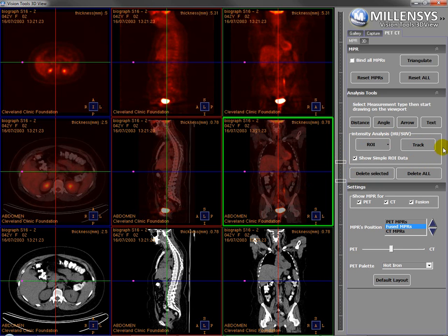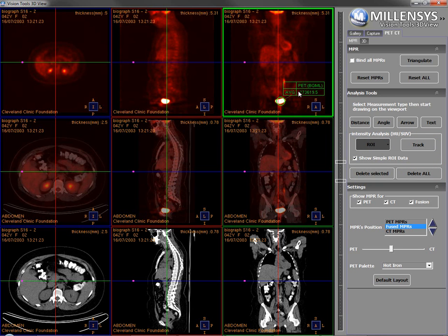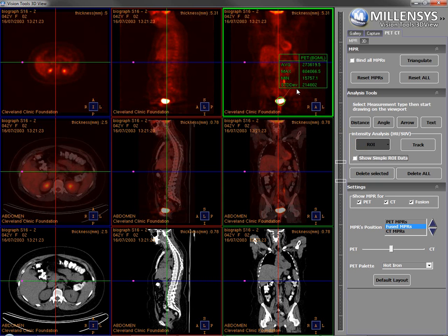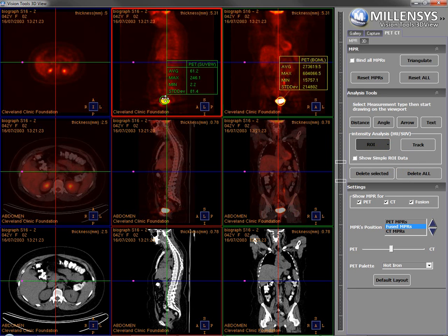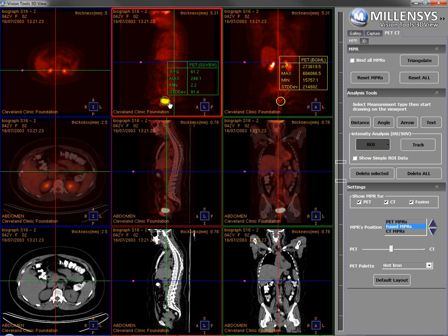Another important analysis tool, especially in PET-CT, is the intensity analysis or the SUV calculations. I can draw a region of interest at any point and I'll have some info on that region — here is the info: the average Bq/mL measurement on that region. I can show detailed information: the average, the maximum, the minimum, and the standard deviation measured in Bq/mL. I can change this measurement to SUV calculations — here we have the measurement not in Bq/mL but in SUV.